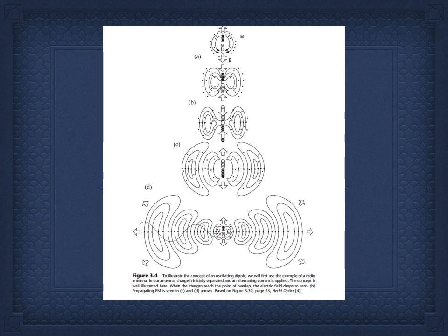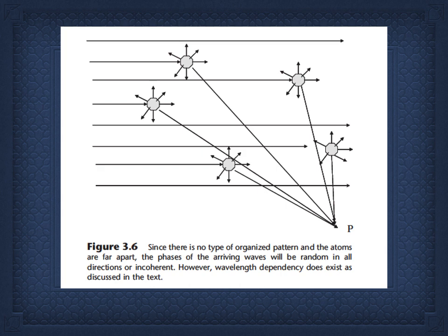And again, this is discussed in far more detail in the textbook. So now, if we have a few scatterers like this that are irregularly arranged, then their phases are going to add up in a complicated manner. So if we take calcium in water, how does it scatter? Well, it depends on how the molecules are arranged. Calcium chloride actually has some degree of penetration, but with aggregates of calcium in lipid, because of the high mismatch, the penetration is extremely poor, and you get scattering.